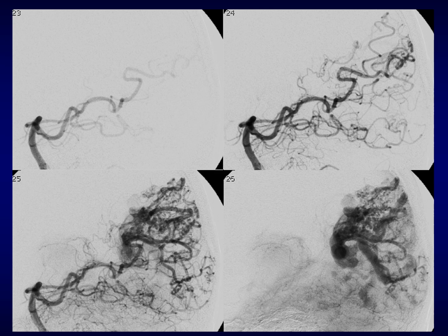This is the lateral view of the injection of the posterior circulation, and you can see the posterior cerebral artery, and you can also see what could be a problem at the level of surgery. This branch runs through the white matter of the parietal lobe towards the AVM, and it's probably the branch that could be difficult to manage surgically.